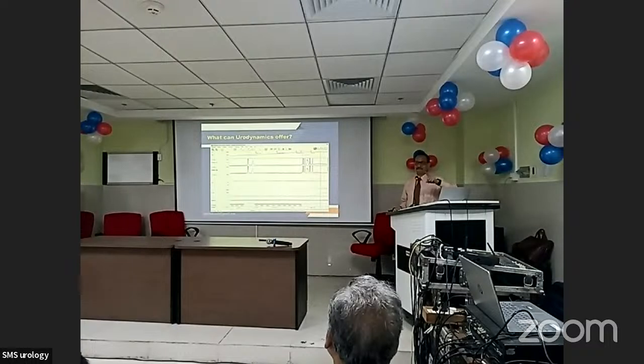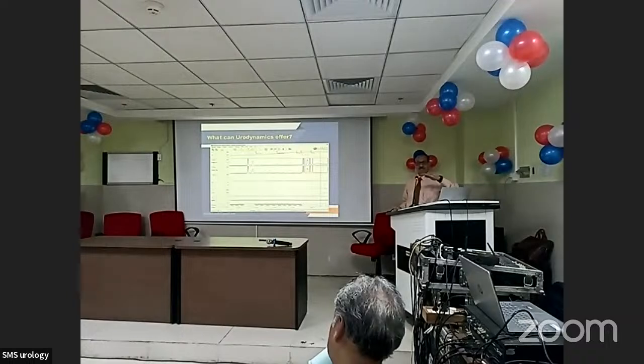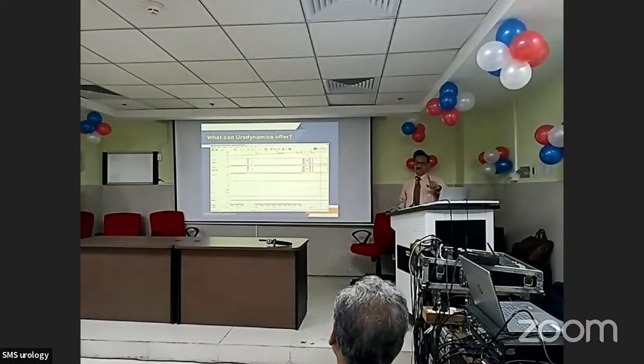They must come together. Now, if in spite of this detrusor pressure she had a very low flow, then I would have said yes, this is detrusor underactivity. That means had she produced a slightly higher contraction, she would have produced a better flow.